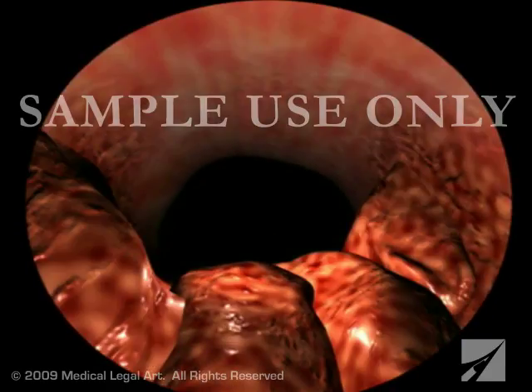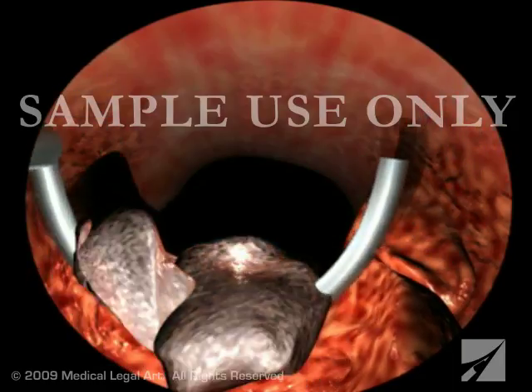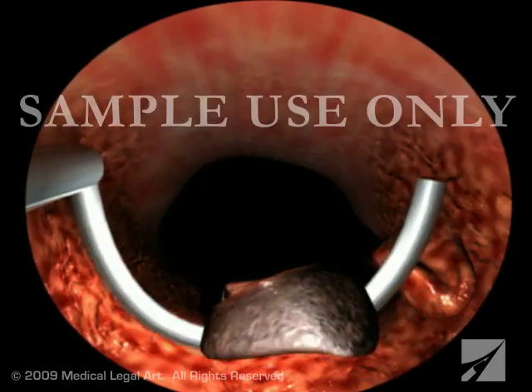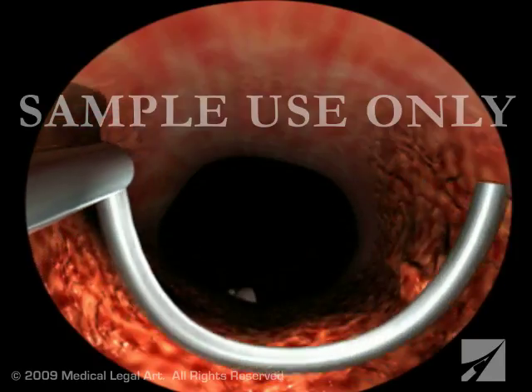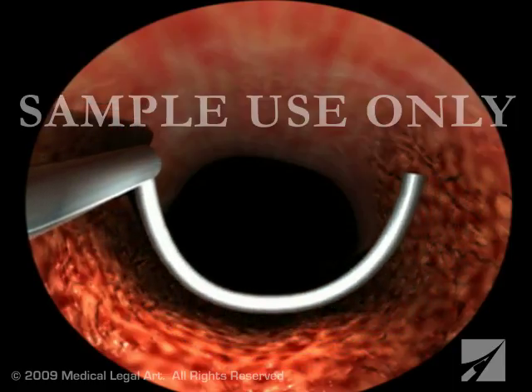He or she will then pass a resectoscope, which essentially consists of a small wire loop carrying an electric current, through the cystoscope and use it to shave off layers of prostate tissue. These bits will be washed into the bladder and out through a special port in the cystoscope.